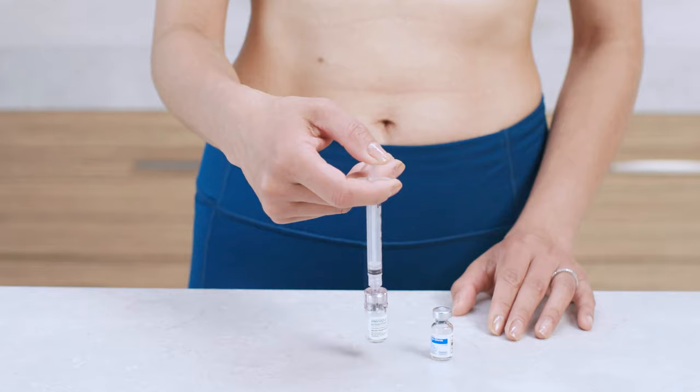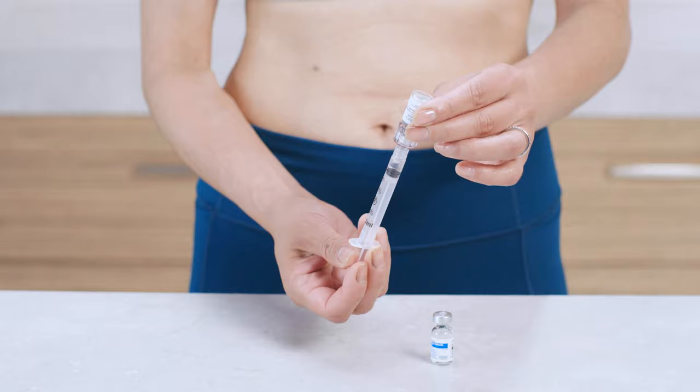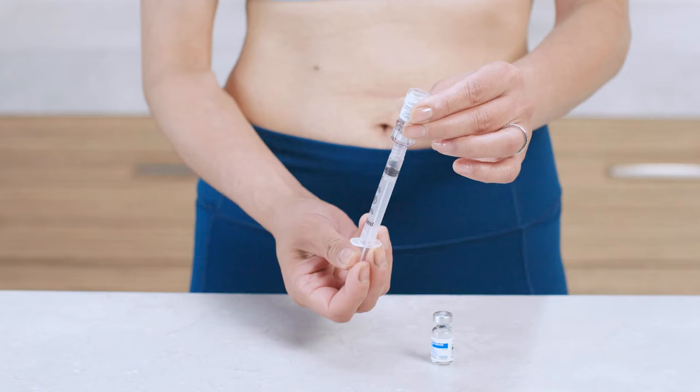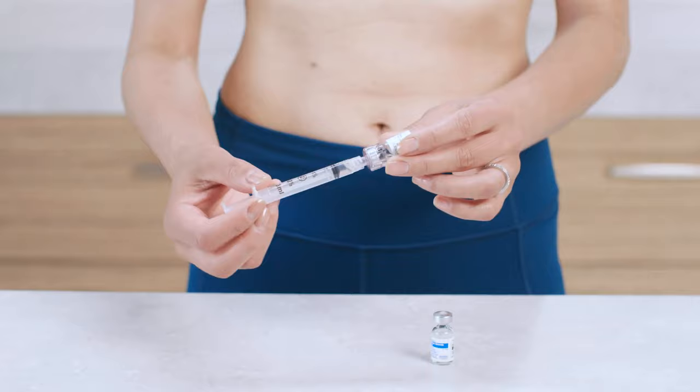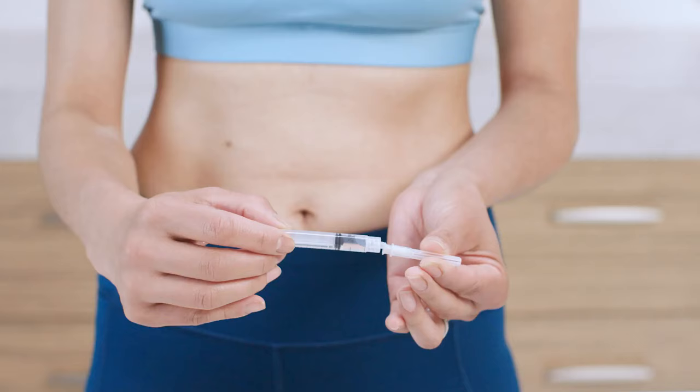Without removing the Q-Cap, turn the vial upside down and slowly pull back the plunger to withdraw all of the liquid. Be careful not to pull the plunger out of the syringe barrel. If your dose is more than one vial, use the syringe you just prepared to mix up to five more Menopur vials — there's no need to add more diluent. If you have any questions, call your healthcare provider. Once everything is mixed, twist the syringe to remove it from the Q-Cap. Toss the Q-Cap and vial into the sharps container.